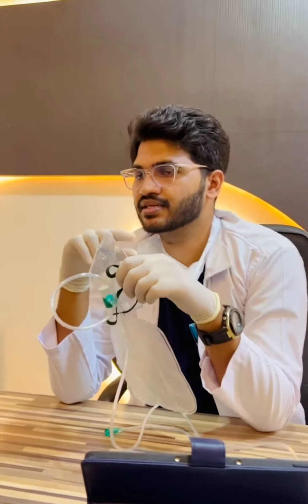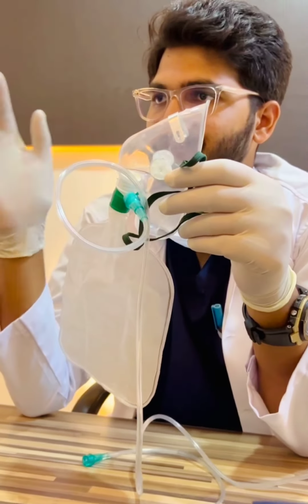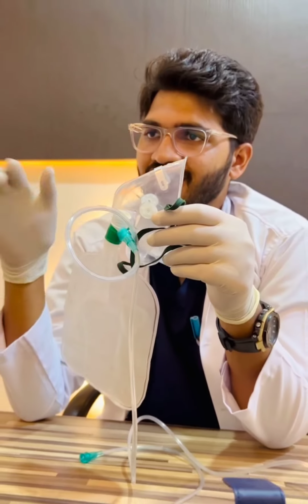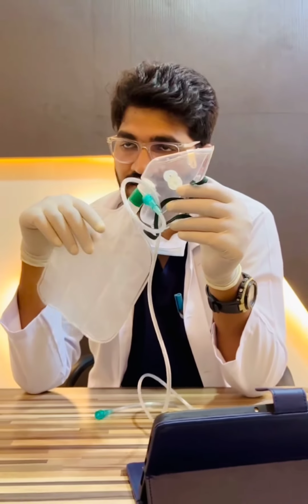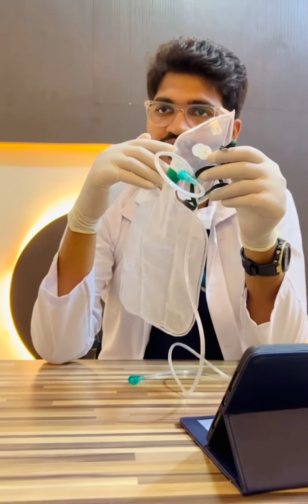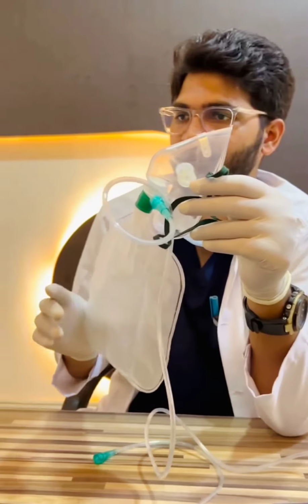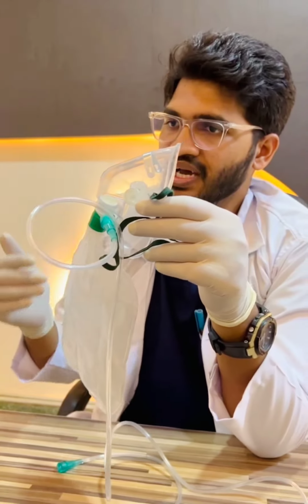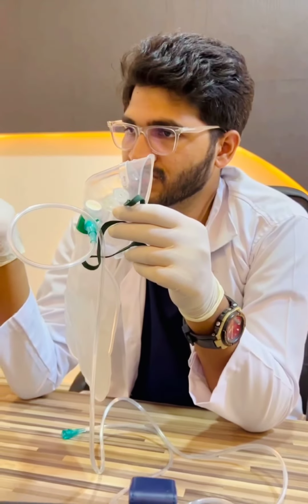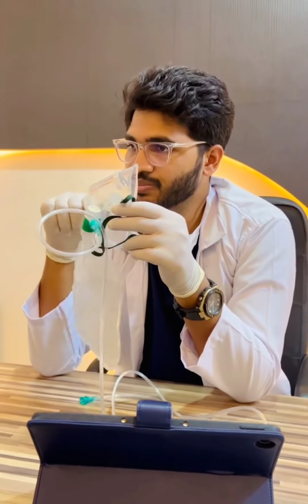Next, we will talk about the non-rebreathable mask. If a patient needs more oxygen, then we go to the non-rebreathing mask, which is like a normal oxygen mask that has a reservoir bag. To deliver 85% oxygen to the patient, we use the non-rebreathing mask, or we call it the high flow mask. To use this, first the reservoir bag must be inflated before use. We use around 15 liters flow of oxygen and the mask should be tight fitting. Any patient who needs this type may need more attention in the emergency department.